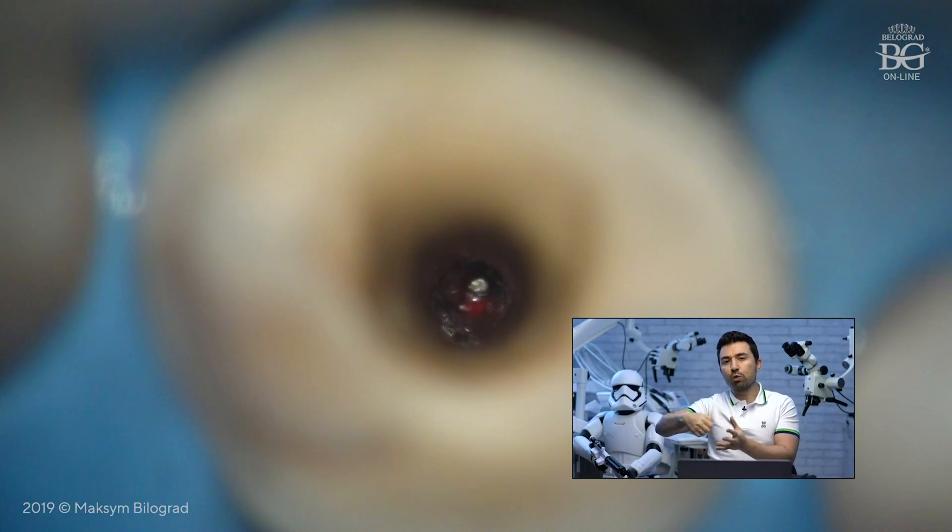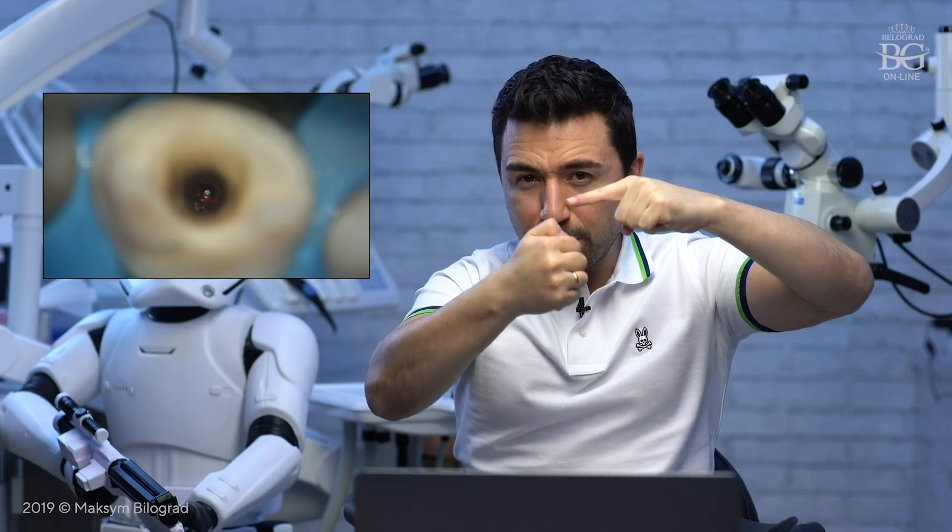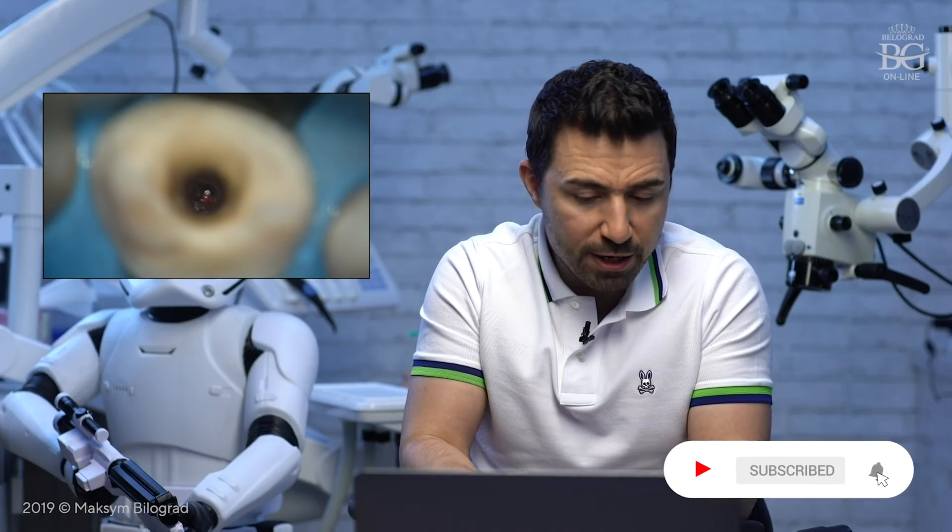The second portion will be mixed MTA. Take mixed MTA and place it into the root canal with the plugger and pack it. Then take your ultrasonic tip, place it against the hand plugger inside the canal, and pack, pack, pack — the MTA will get more compressed and set faster. If you have a limited-time approach, it is better to use gray MTA because gray MTA sets faster, and especially when working with ultrasound it may set within 10 minutes.